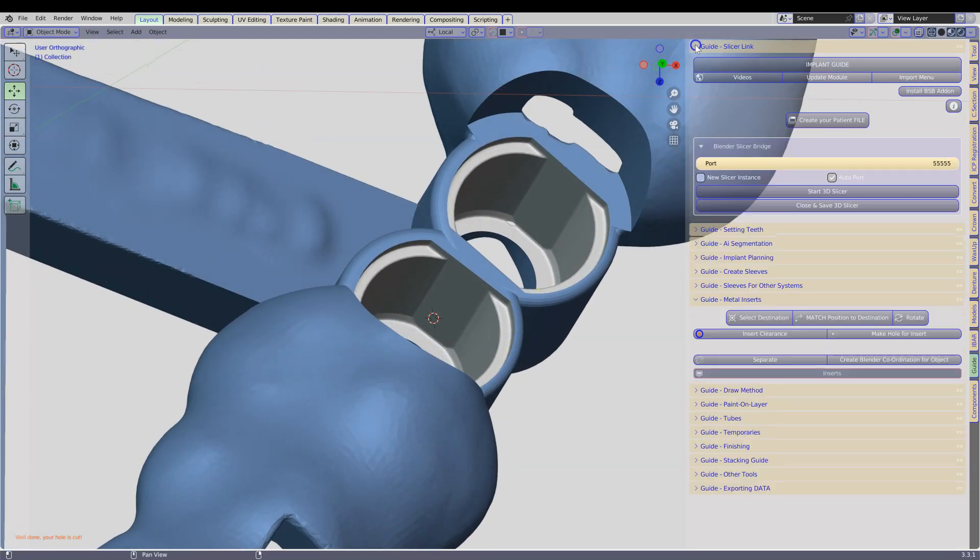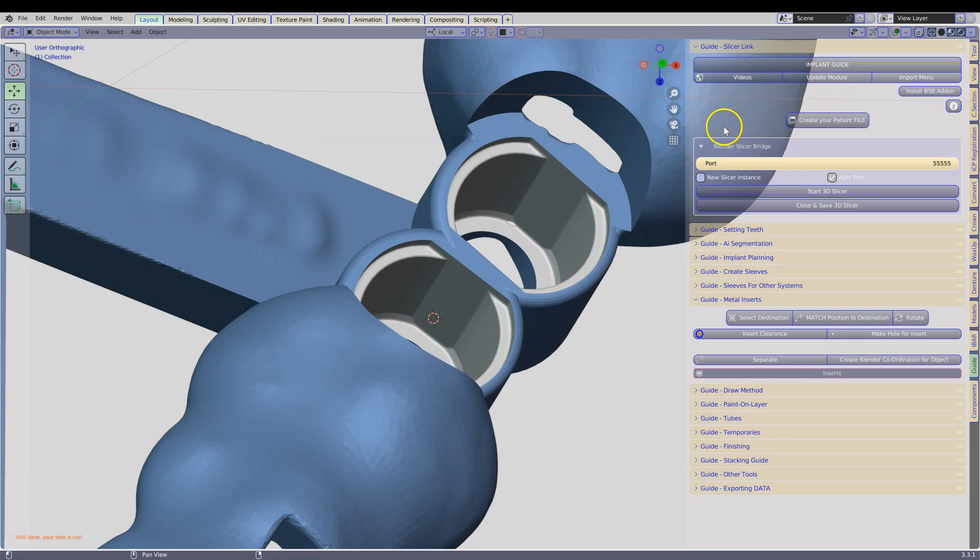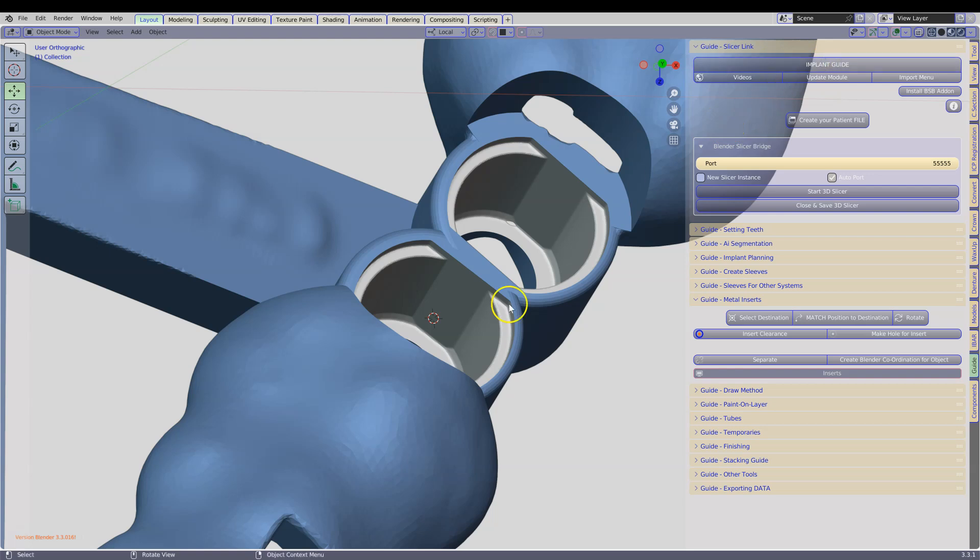Make sure that you click on Update Module to get the new scripts. And also when you click on Implant Guide, you should be able to see the version in the lower left hand corner.